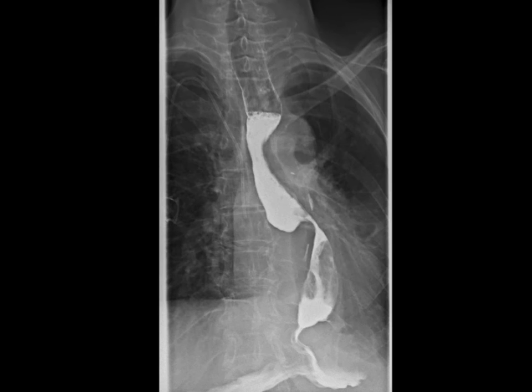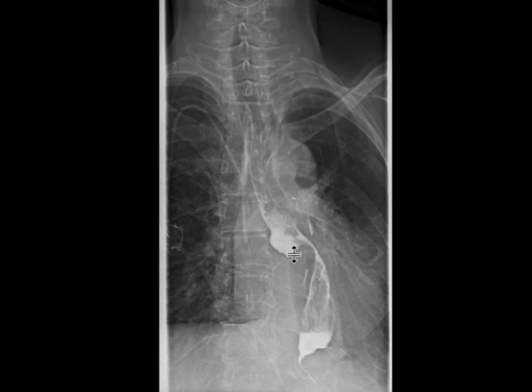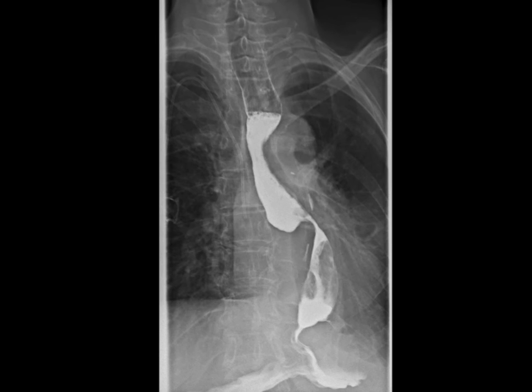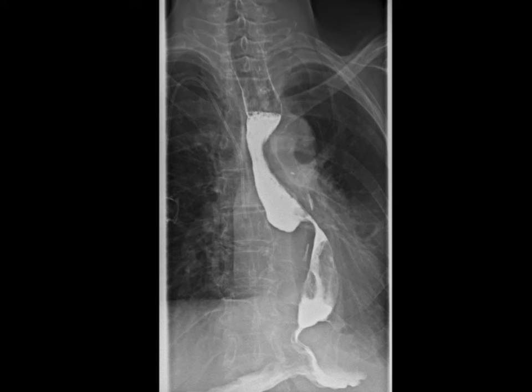Now, cephalad to that stricture, we can see that there's this focal outpouching as well — a little diverticulum seen just cephalad to it. This is a nice shot that shows the stricture and the outpouching cephalad to it. Some of the contrast is held up upstream from the stricture while some contrast gets through. This was thought to represent a radiation-induced esophageal stricture. Remember, the patient had a history of lung cancer and radiation therapy, and there was a little traction diverticulum that developed just cephalad to this.